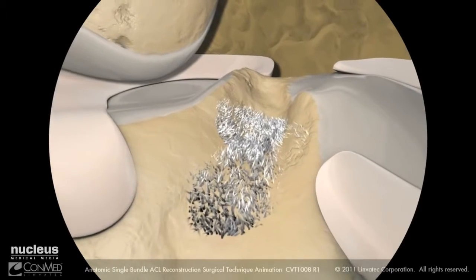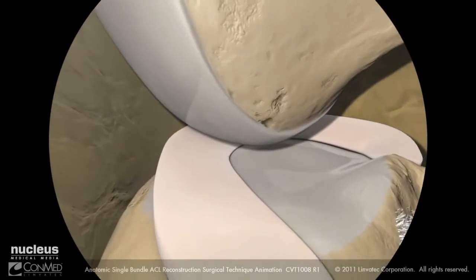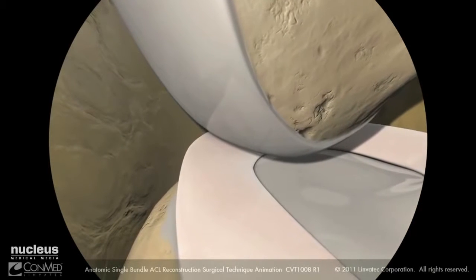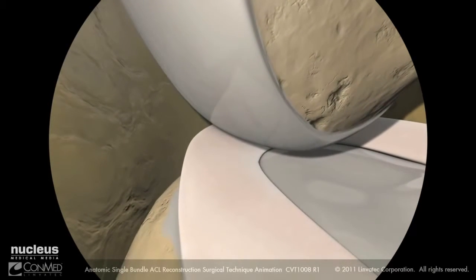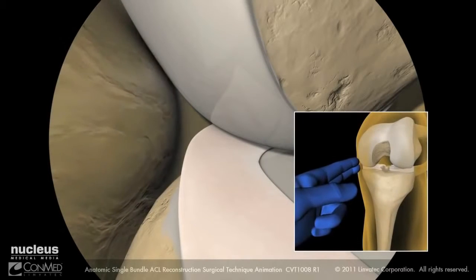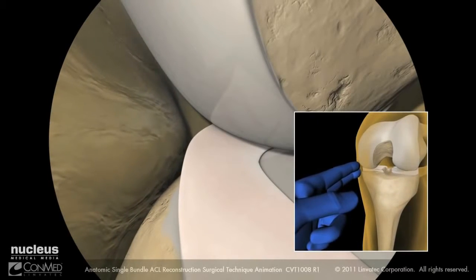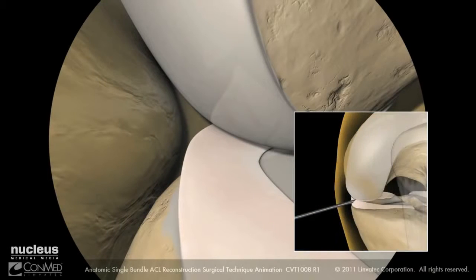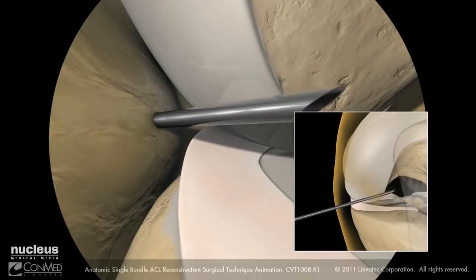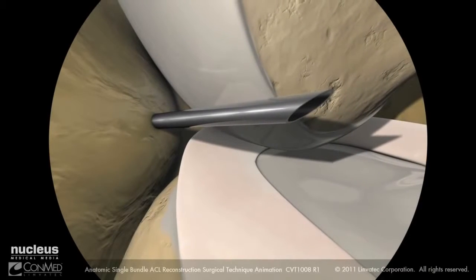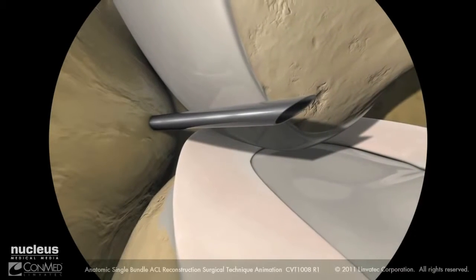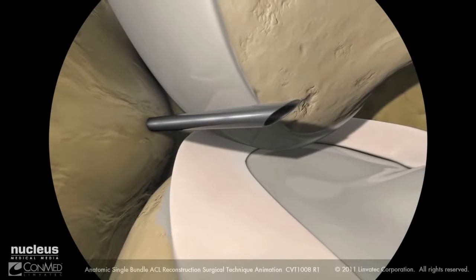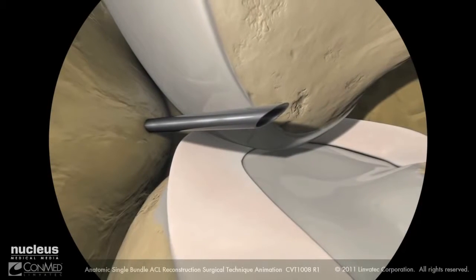Creation of the accessory anteromedial portal is made under direct visualization with the arthroscope placed in the anterolateral portal looking medially. With the knee flexed at 90 degrees, palpate the medial joint line. Under direct visualization, insert a needle just anterior to the medial femoral condyle directed towards the intercondylar notch. The needle should be above the medial meniscus to avoid damage.